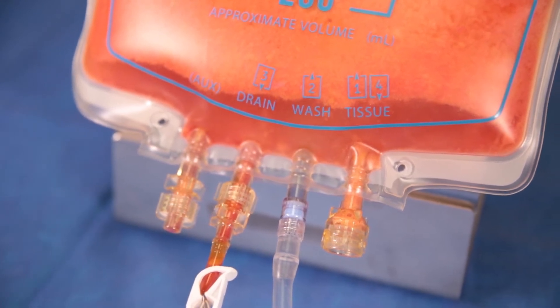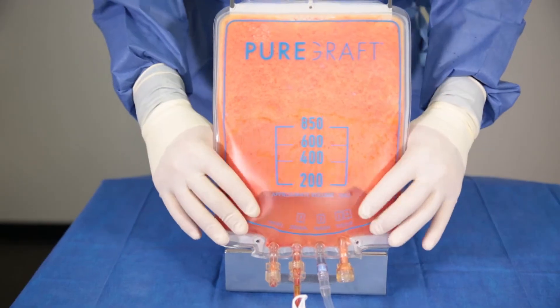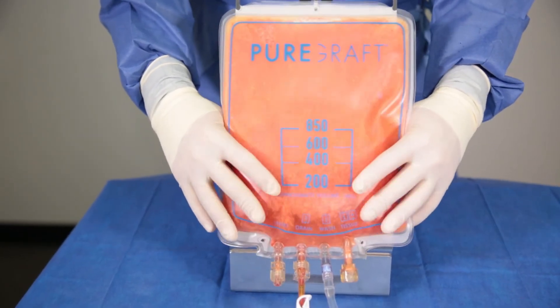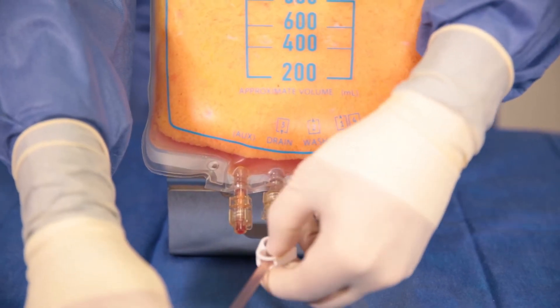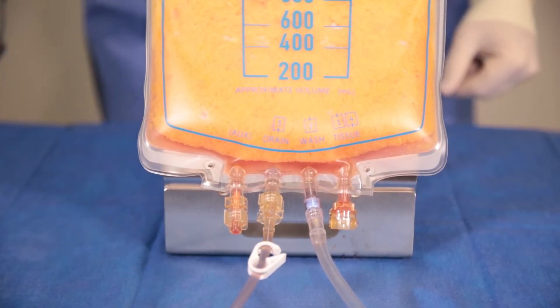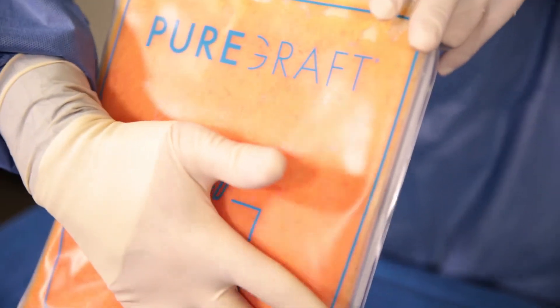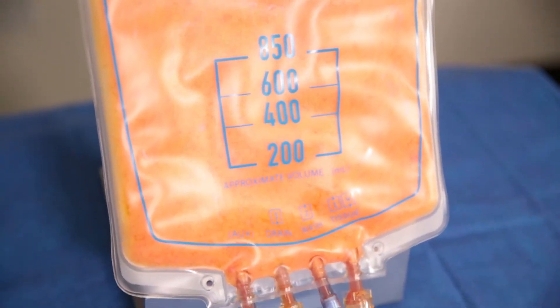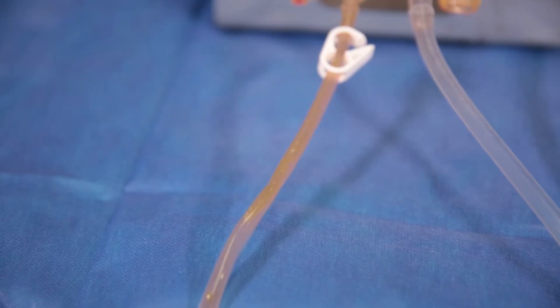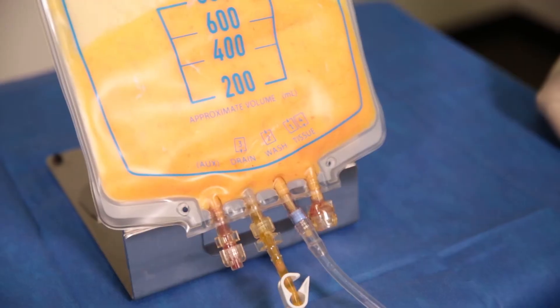It is advised that the pump is set to its maximum speed for the greatest efficiency. Mix the Lactated Ringers with the lipoaspirate for 20 to 30 seconds, then open the drain clamp and allow the waste to drain for approximately three minutes. To expedite the drain process, continue agitating the bag. This entire process will be repeated a second time until the fat is adequately purified. If the user desires extra dry tissue, leave the drain open until the fat is close to a toothpaste-like consistency.